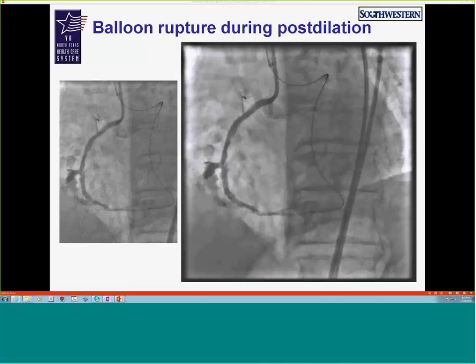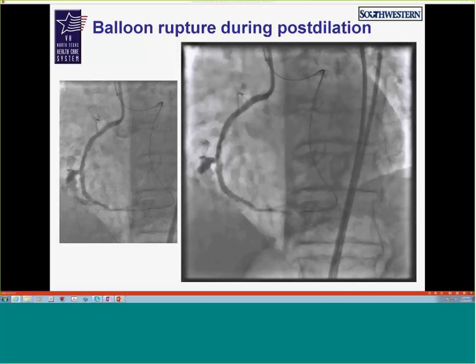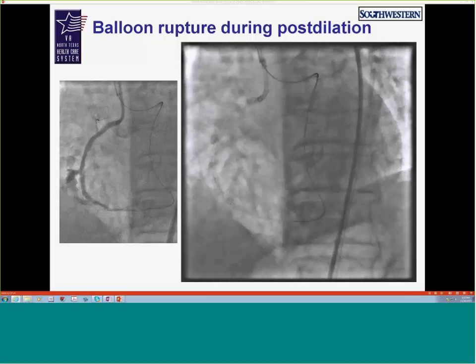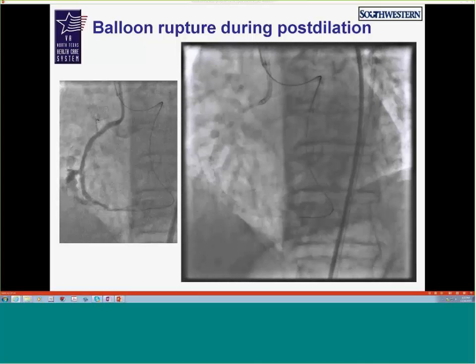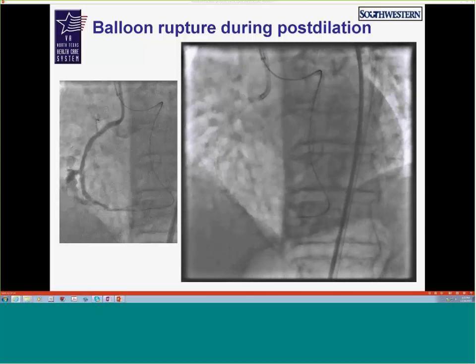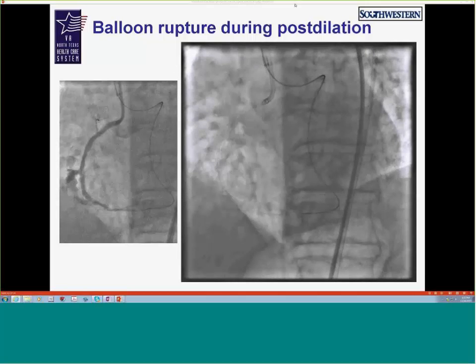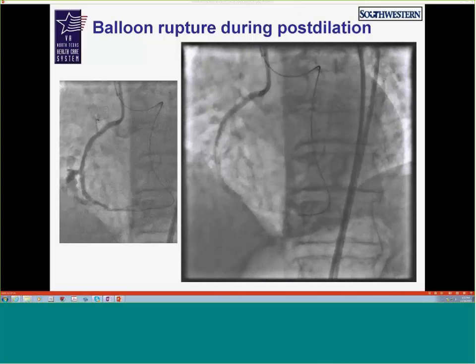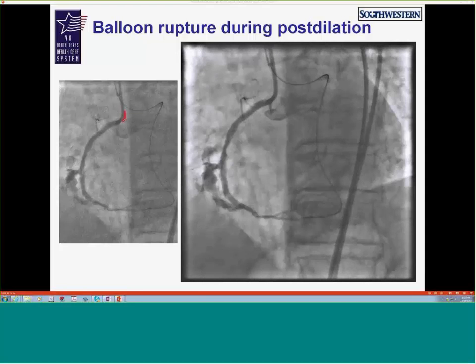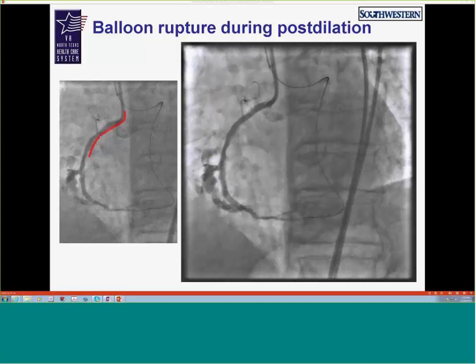I was thinking about this. Why couldn't you, at this point in the case, put a wire antegradely with a balloon and just stop the flow there? Then you can take out the wire that is externalized, and use that particular access to go in and fix the perforation, because you don't need anything retrograde anymore. If I'm not correct. True. I agree with you, but maybe we have the antegrade guide, and you can put a wire through this. Correct. So you don't have to actually pull the retrograde wire out. You can keep that.